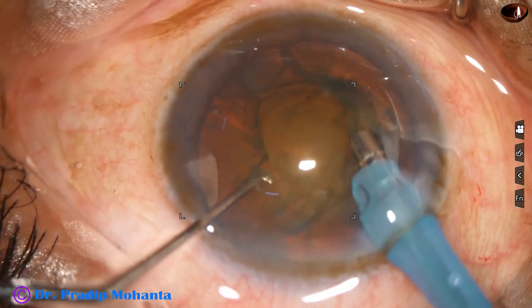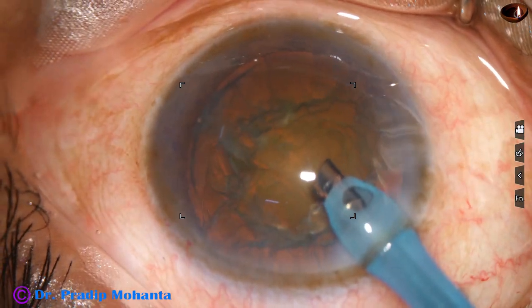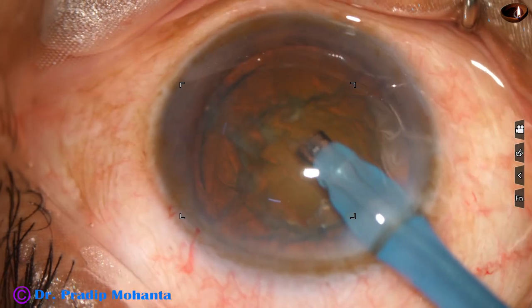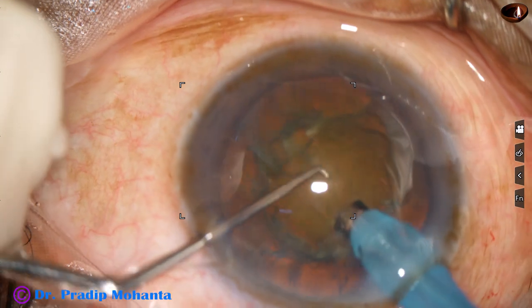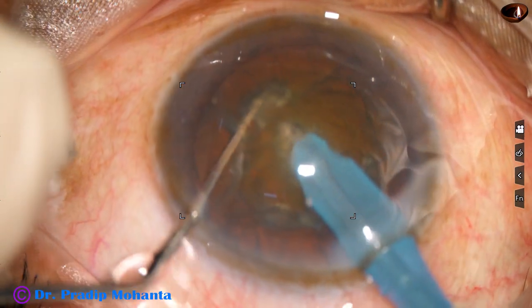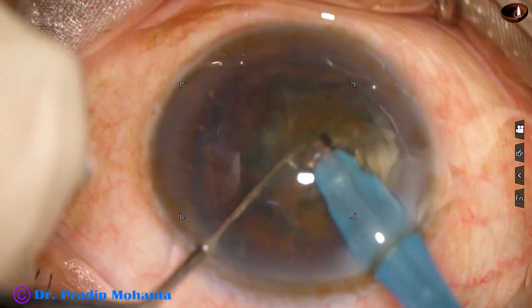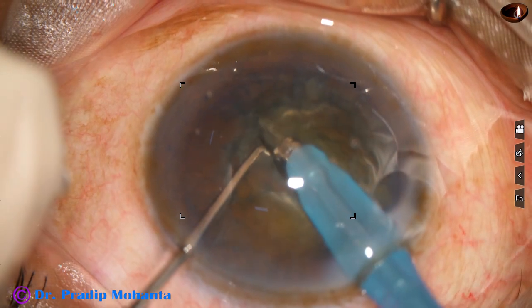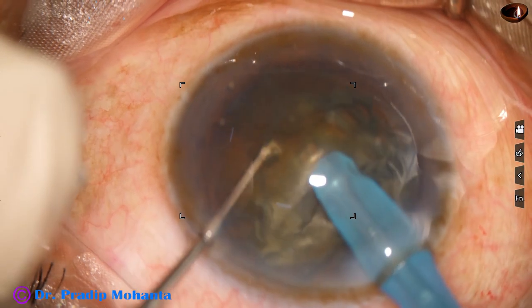Some superficial cortical lens matter is removed, and now the handpiece is turned to make the bevel up. The tip is buried into the substance of the nucleus and goes through towards the opposite equator. A nice crack is obtained. The nucleus is rotated 180 degrees and it is separated completely.